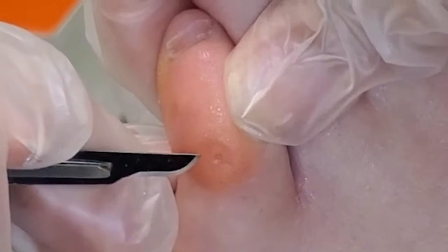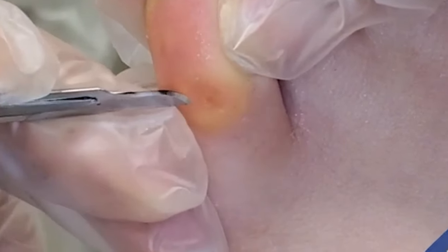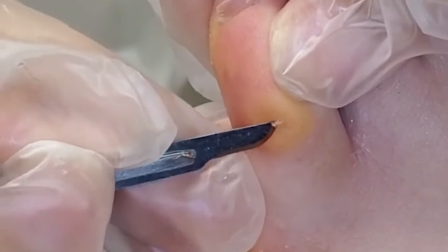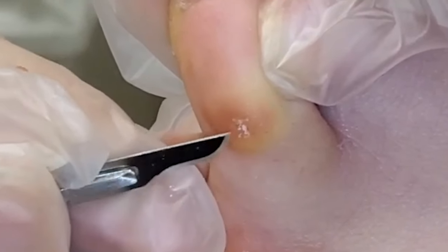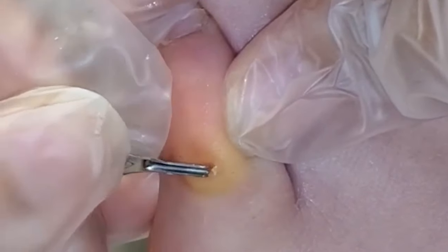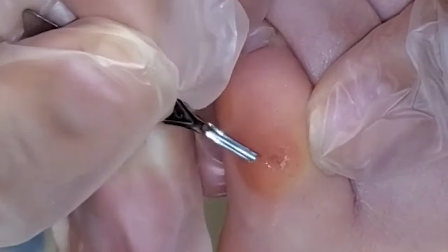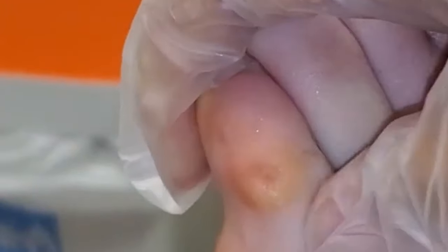Just come towards me a little bit so I can see. It's tiny — it's not perfectly round, it's a little bit irregular. You can hear it — that's all your hard skin tissue. You can still see a core. This one might bleed, to be honest, because it's so deep.